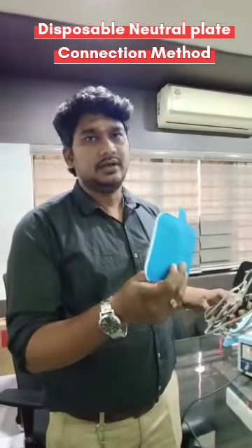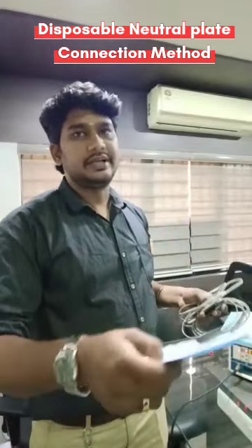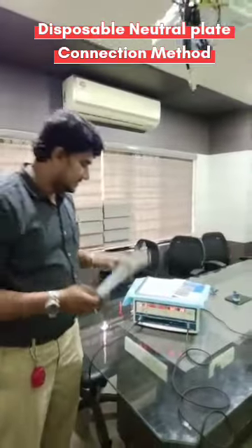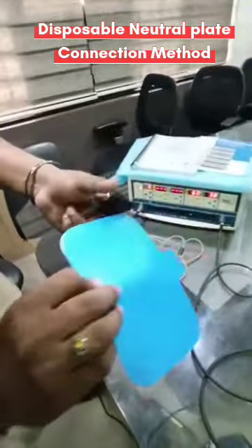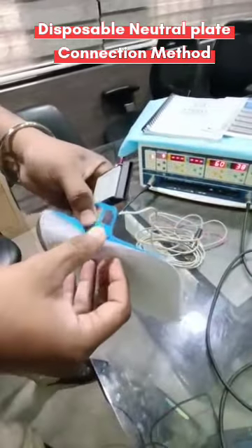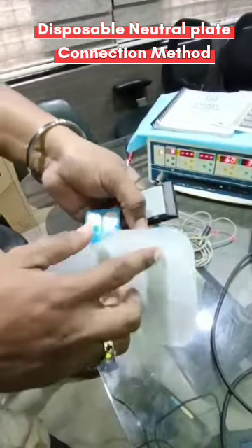The cable is a reusable one and this plate is a disposable one. Whenever you want to dispose it, you can remove this plate, throw it away, and reuse the cable. So that's how the setup works. This is the plate — the back side will be insulated and inside you can see the jelly area.